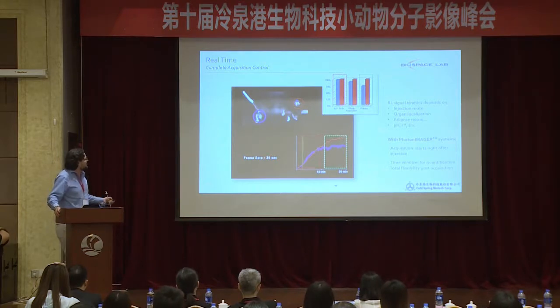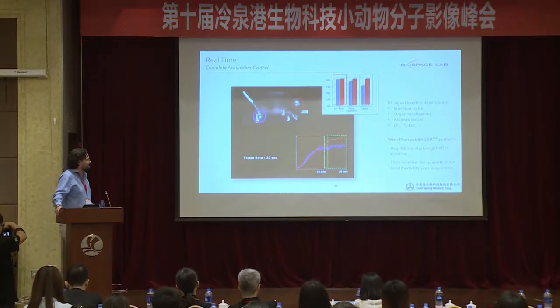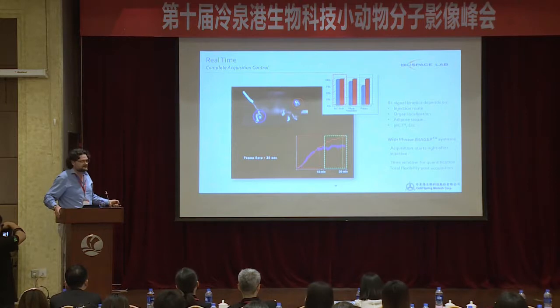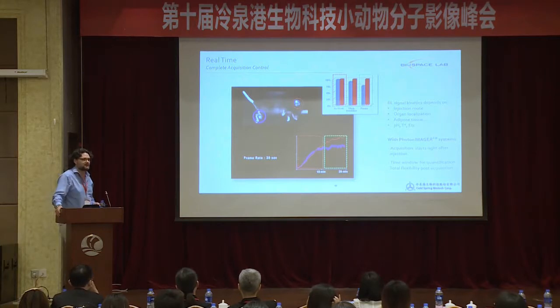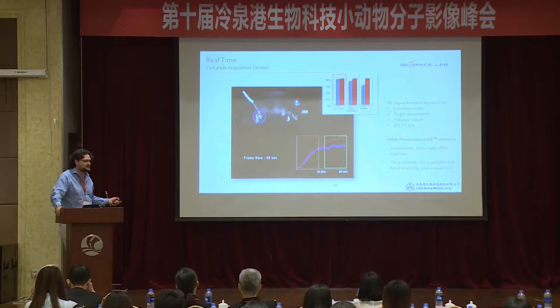But here's a quick example where you're looking at two tumors which look like they have the same kind of signal, and if you were looking at the signal at the early phase of the integration, you would think that the two signals are the same. However, they're not, because here you're not measuring at the right time. You're forgetting that the enzyme kinetics of bioluminescence involves substrate diffusion through the tissue. So here, you are not at the steady state of the enzyme, and you're not monitoring enzyme activity, and therefore you're not measuring the difference in number of cells, but you're actually measuring the diffusion rate of the substrate to the enzyme.